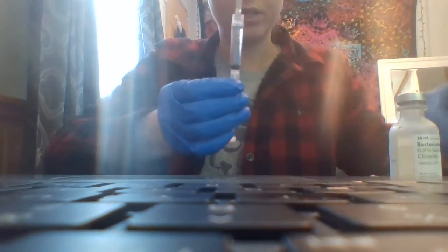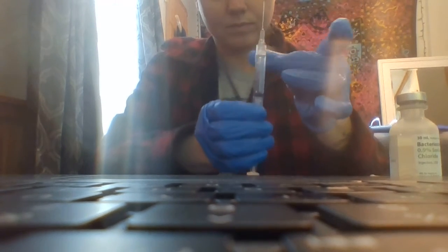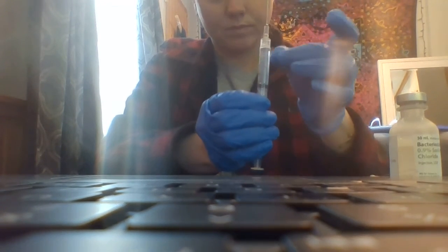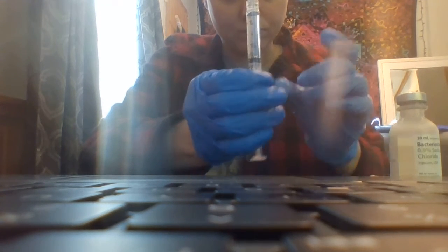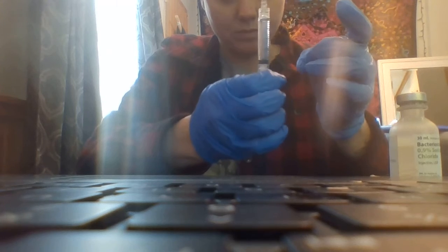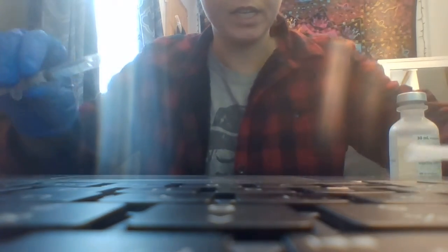I'm going to make sure I don't have any air bubbles. No air bubbles. Now I'll put it here so you can see.